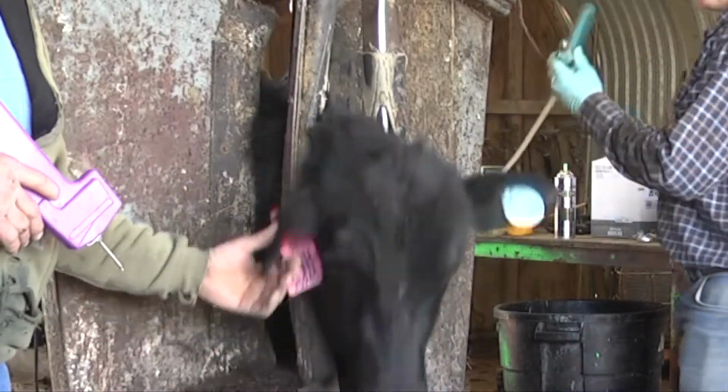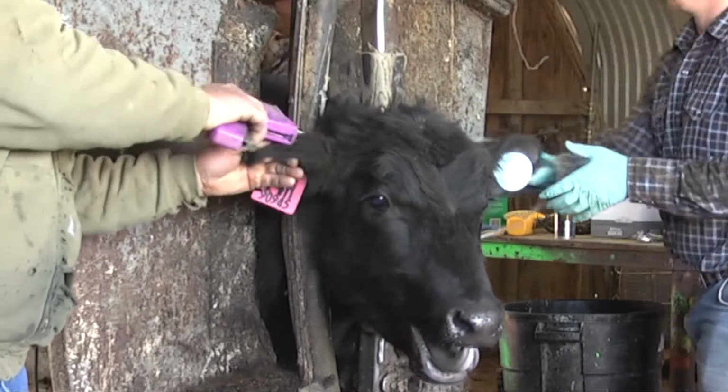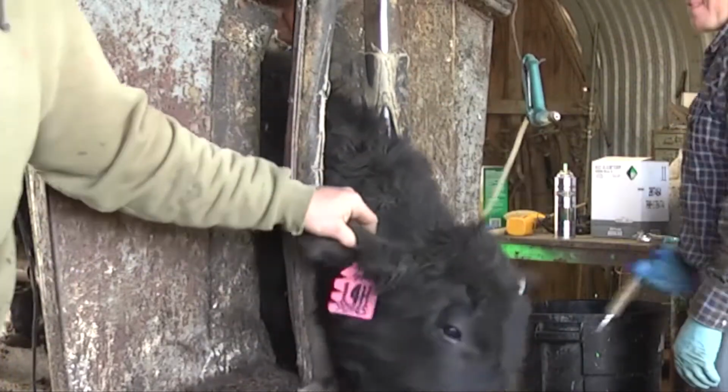If we do all of that, we will decrease the chance of abscess, because we've prepped that ear. We decrease the risk of bunching or crushing. That's one of our failures if we implant incorrectly. We get bunching or crushing, where they won't absorb like they should, and we can run into some other issues. But if we choose the right location, and do it properly and cleanly, we can usually end up with some pretty good results from implanting.